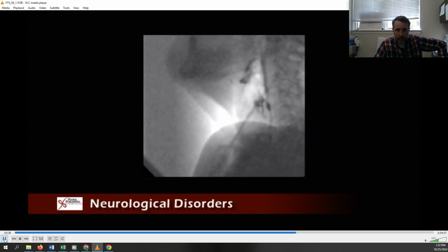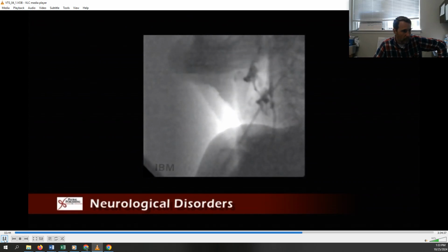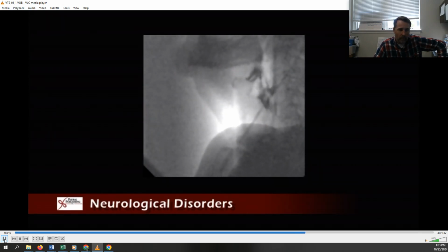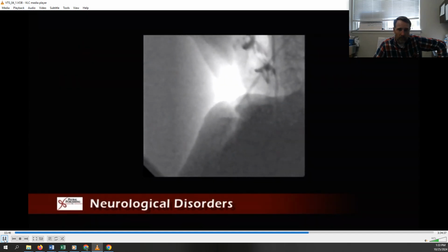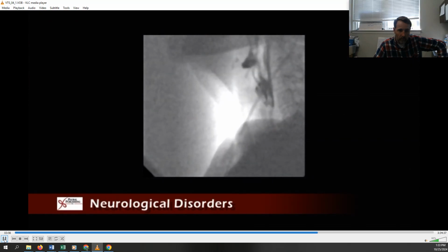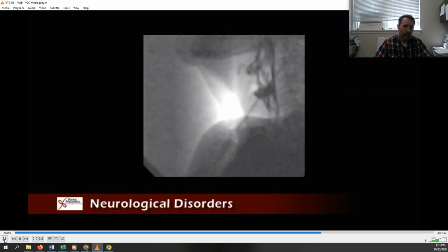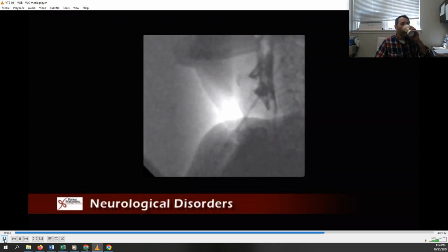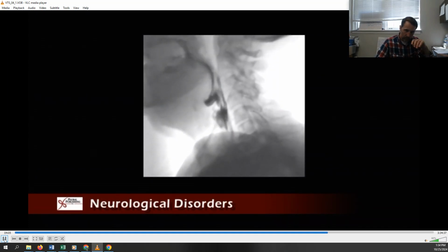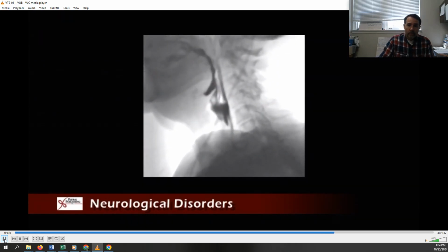This 62-year-old lady was admitted into hospital with significant dysphagia of unknown origin. She was referred by the neurology team to the speech-language pathologist and was placed nil by mouth, also referred to as nothing by mouth, based on a clinical bedside assessment. Also referred to as being NPO. A nasogastric tube was inserted to address her nutrition and hydration requirements while work to form a diagnosis was conducted. She was referred for a video fluoroscopy to establish the nature of her dysphagia.